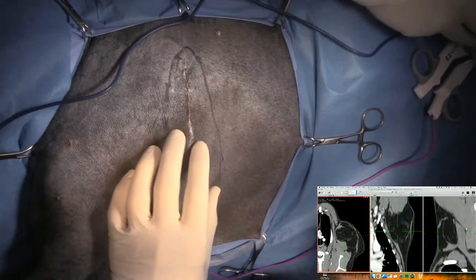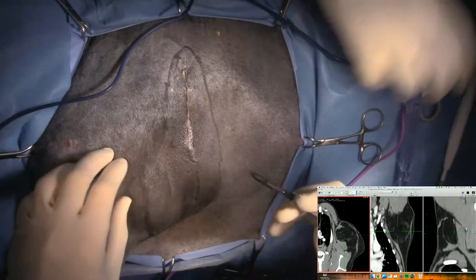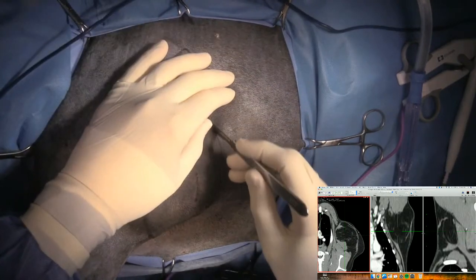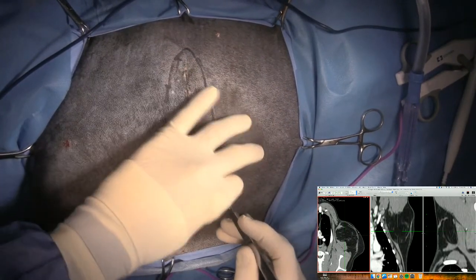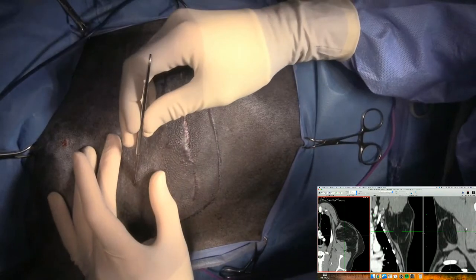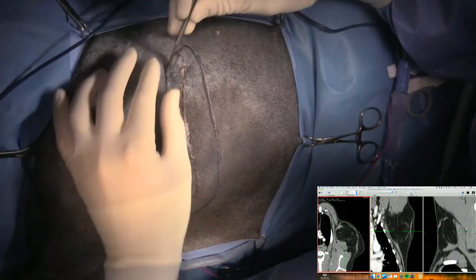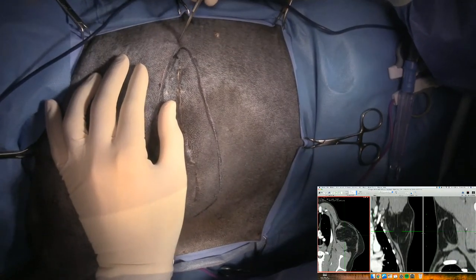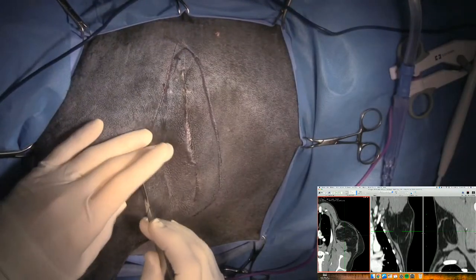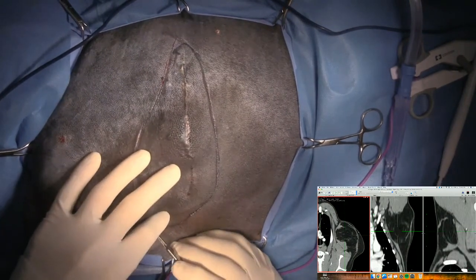So this is a dog that has an infiltrative lipoma that's right here. If you look down on the right-hand side of the screen, you can see the CT scan, the multiplanar reconstruction. This dog has had a couple of surgeries before to remove this thing, and it's come back. It's an infiltrative lipoma originating from the latissimus dorsi muscle, and unless you take that whole latissimus dorsi muscle out, you are not going to resolve this problem.